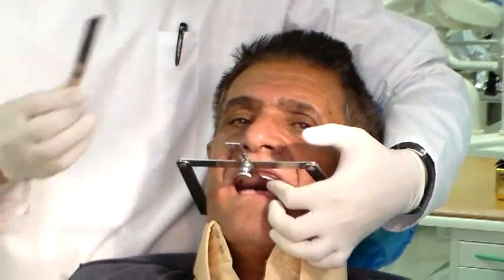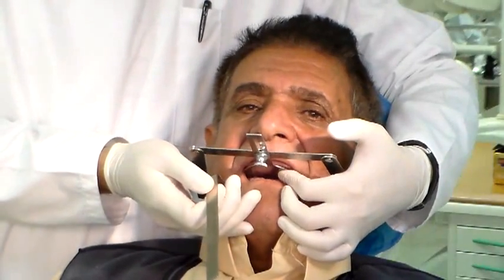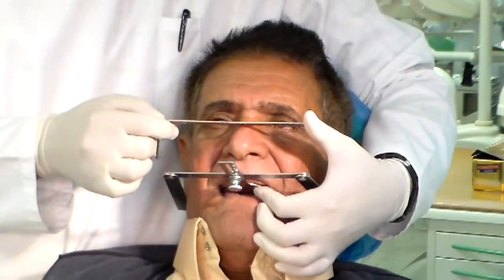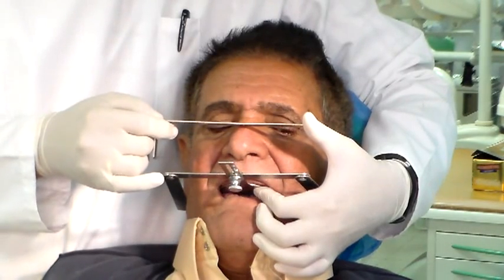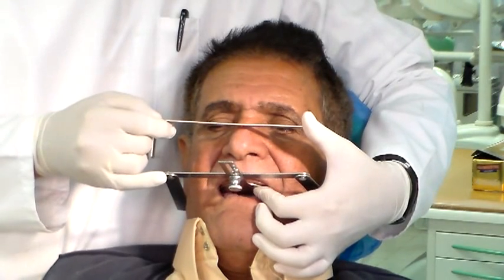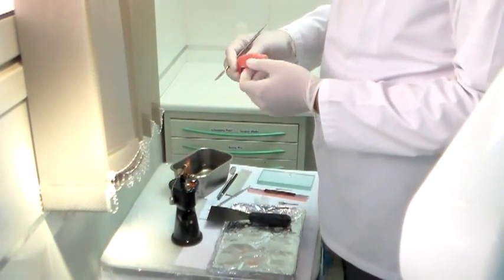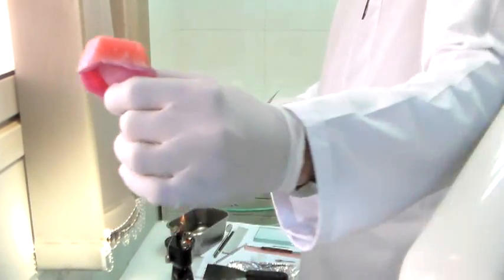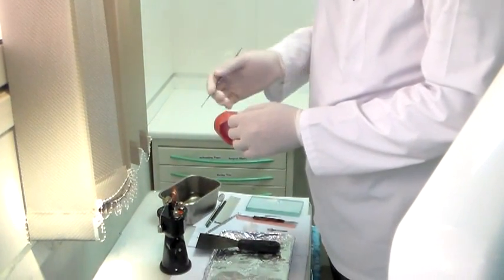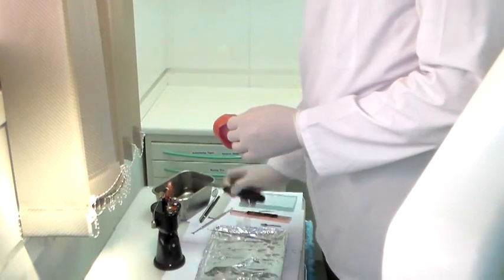Tell me if it's parallel to the camera. The interpupillary line is parallel, but you can see this side of the Fox plane is lower than the other side. Let me try to reduce wax from this side. This side seems to be needing some reduction, so I'm putting a small line in that region just to see how much I want to reduce. The problem is when you start to reduce you cannot see anything — if you don't put a line, you don't know how much you're reducing, and when you end up reducing too much, you want some kind of limit so you know where to stop.